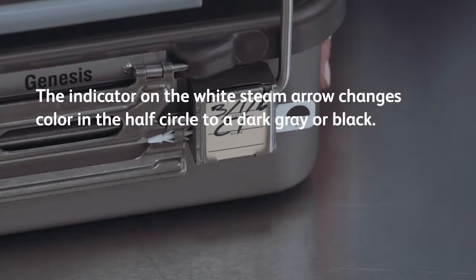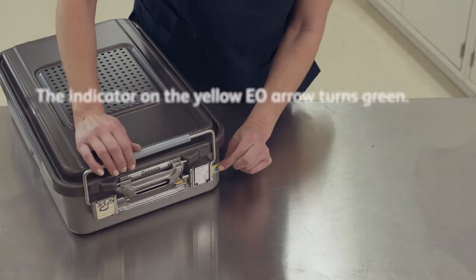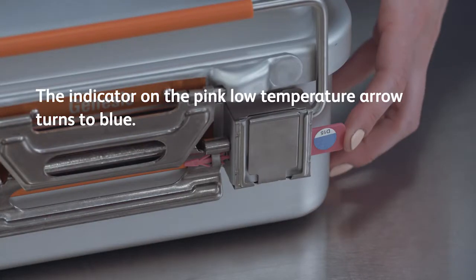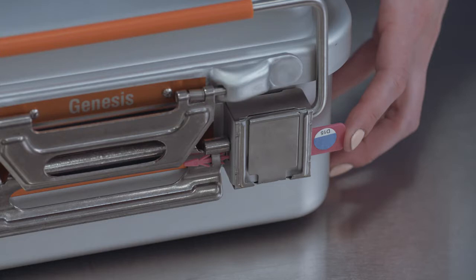Check for the appropriate color change of the chemical indicator dot found on the tamper-evident arrows. A chemical indicator that has changed color differentiates a processed indicator from an unprocessed one. As long as there is color change, the indicator has reacted sufficiently. The chemical indicators on the tamper-evident arrows are not an indicator of sterility.